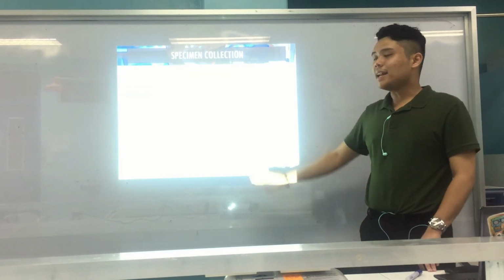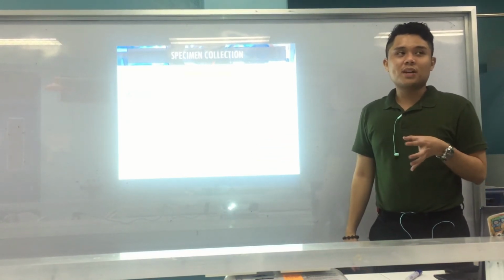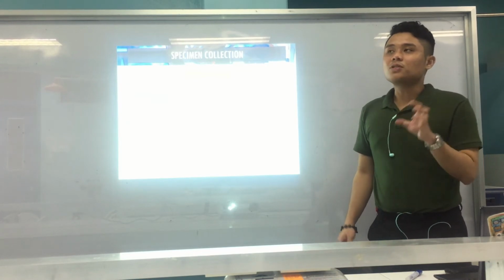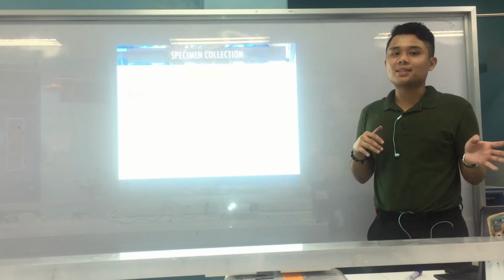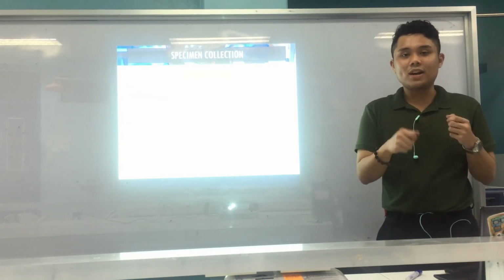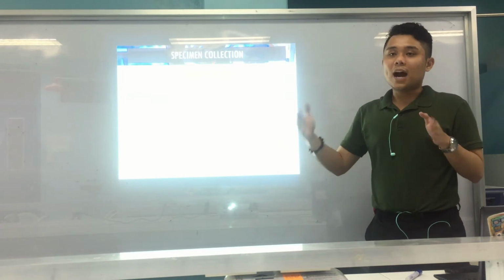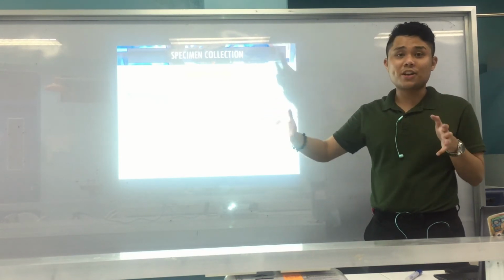Okay? Alright. And, of course, as mentioned in the lecture on swab specimens, most of your swab specimens, if not all, if we want to culture them, are usually put in a transport medium. Because again, in most situations, your patients are far from the laboratory or the testing site. So it would take time to travel from where it was collected to the point of inoculation or culture. That travel time could play a significant role in our isolation, because that time can cause deterioration of your organisms.